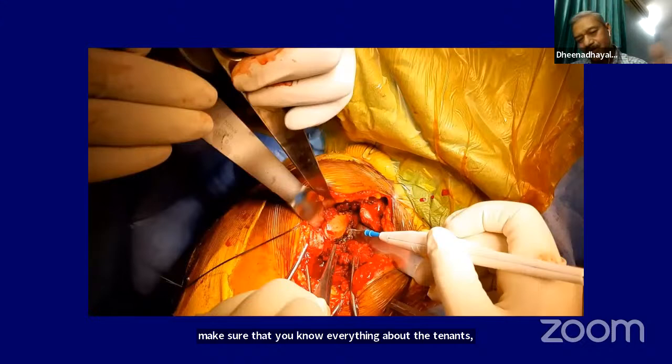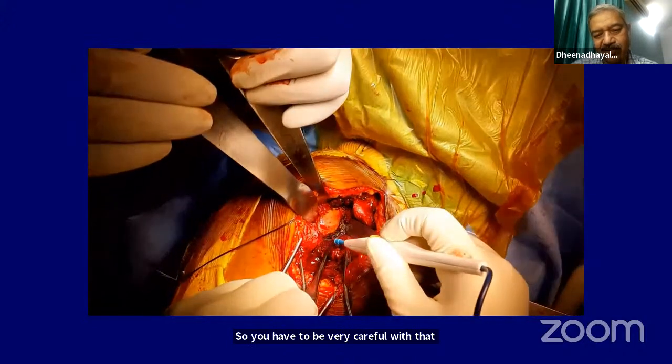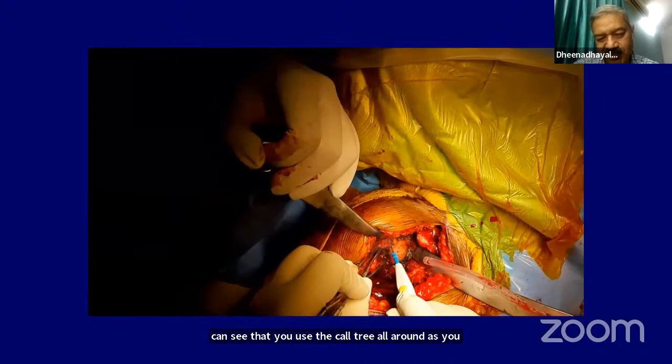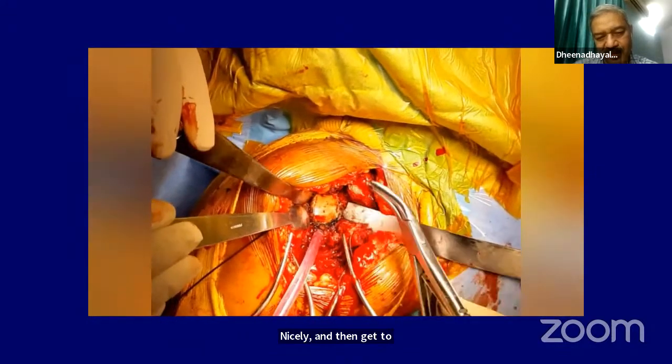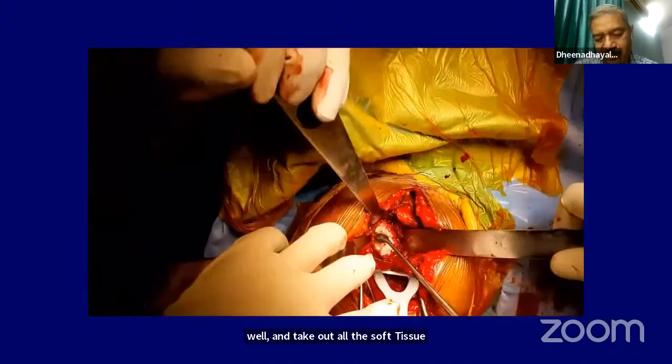When you are doing the replacement, the amount of release you do is very important. The release must be done all around the glenoid, and when you are going down, do not disturb the triceps insertion. If the triceps is released, there will be weakness in extension of the elbow. Use cautery all around, slowly dissect it out using these instruments nicely, and remove all the soft tissue attachments before getting to the glenoid preparation.